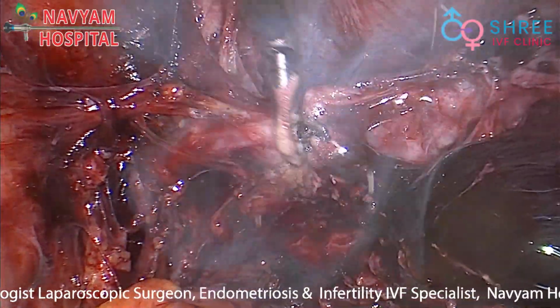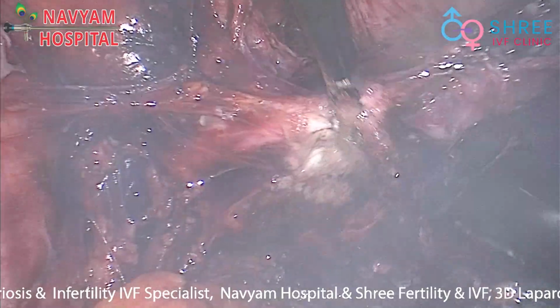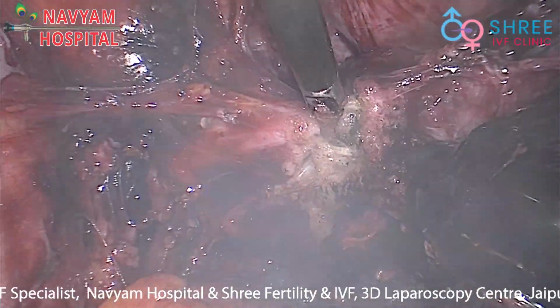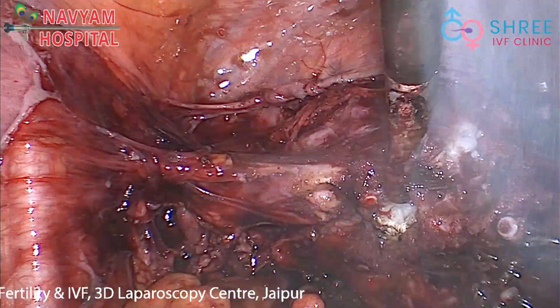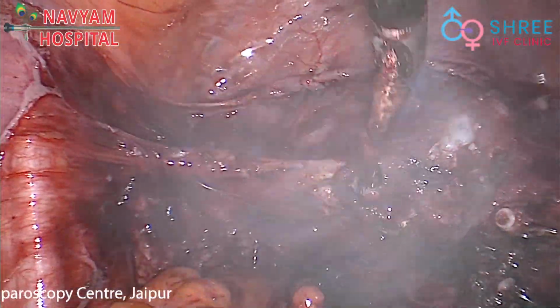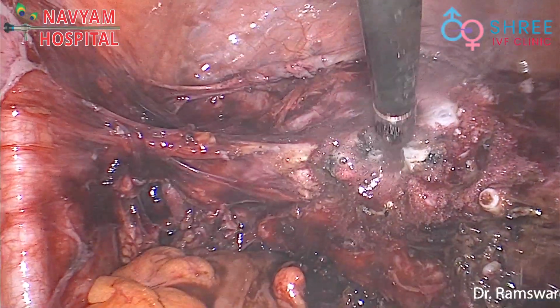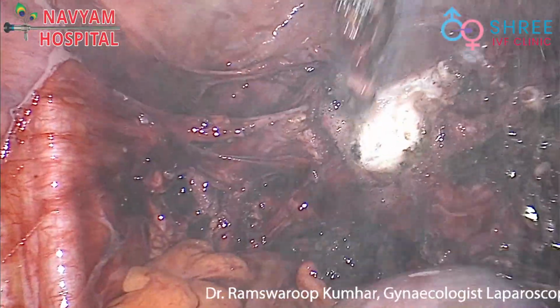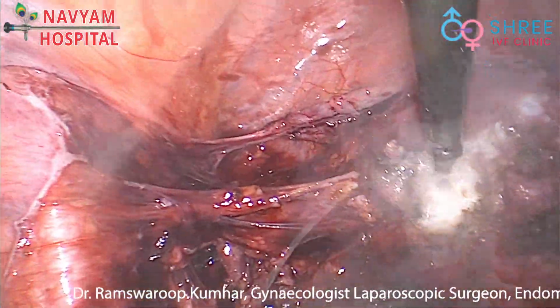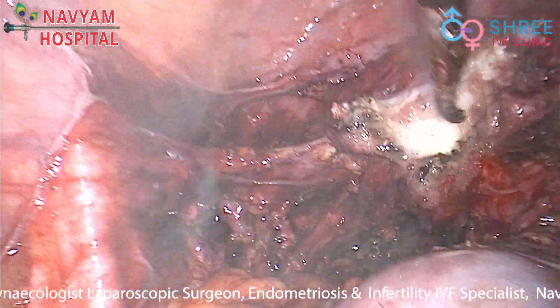For this ligation, we don't need to skeletonize the uterine artery and vein and the vessels separately. So we have to coagulate the whole bunch and then cut it open and lateralize it very well. You can see the rotation movement of the shear tip for the cutting and the lateralization are different.